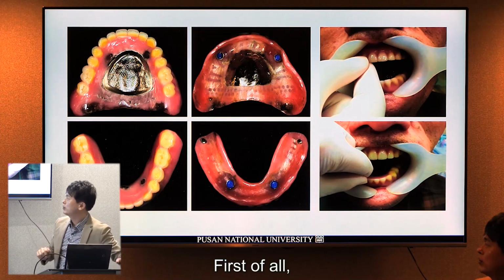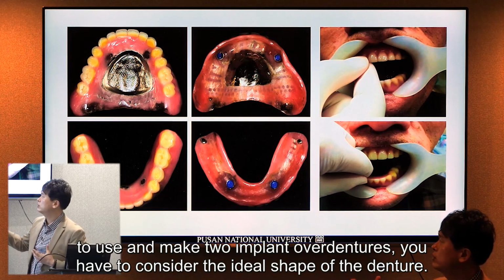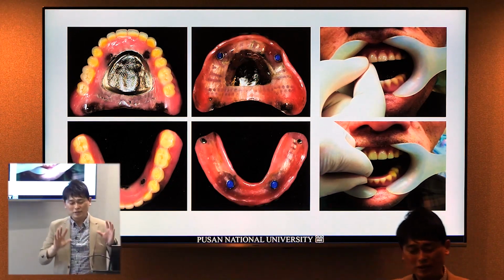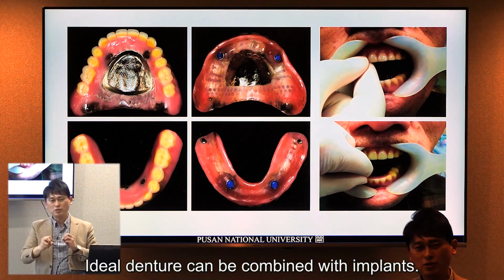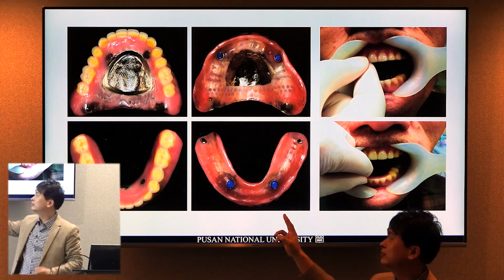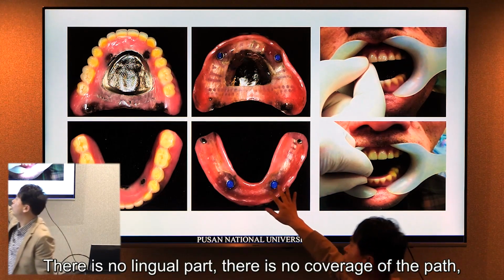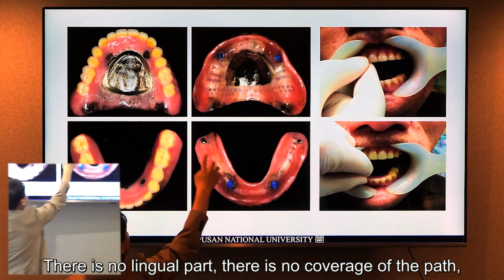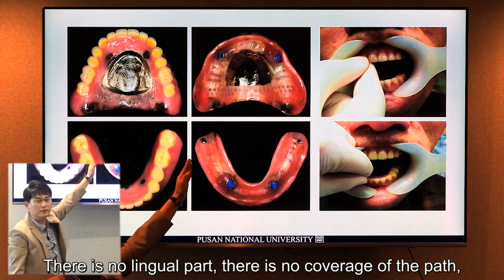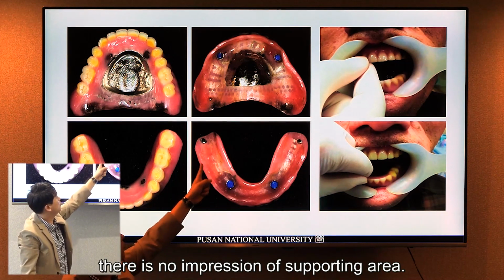So first of all, to make the two implant overdenture, you have to consider the ideal shape of the denture. What I mean is, an ideal denture can be combined with implants. What's the problem in this case? There is no lingual part. There is no cover of the retromolar pad. There is no impression of the supporting area.